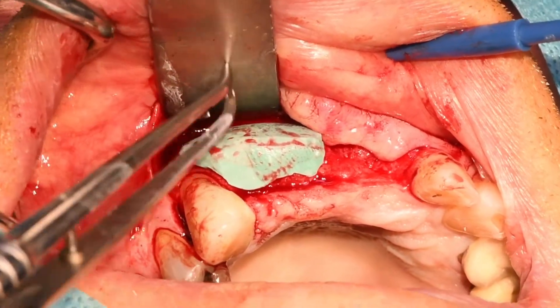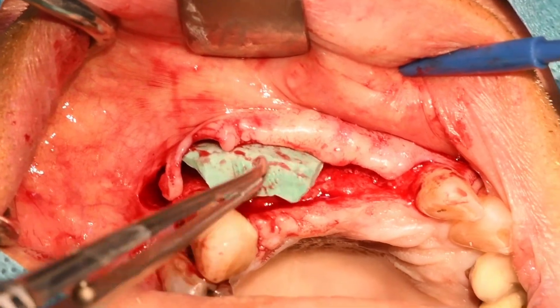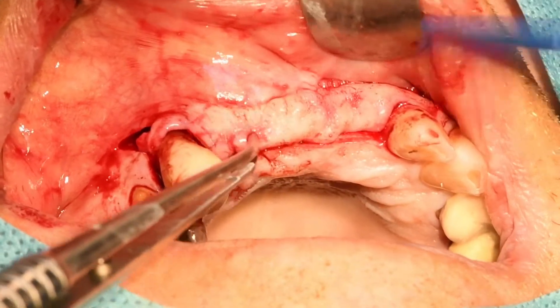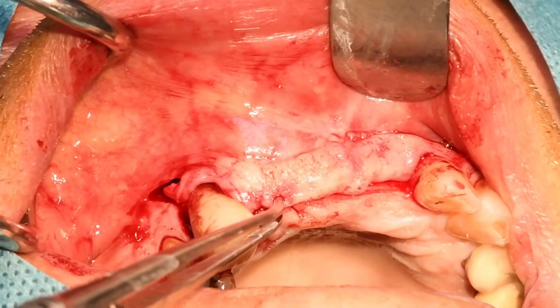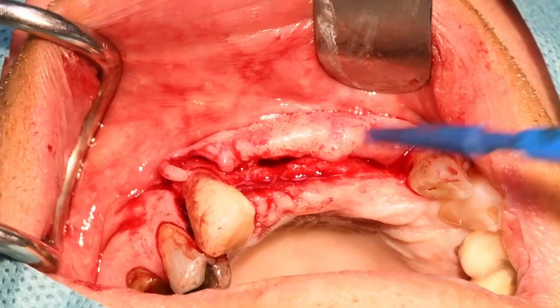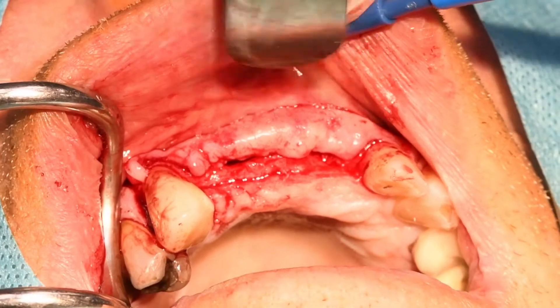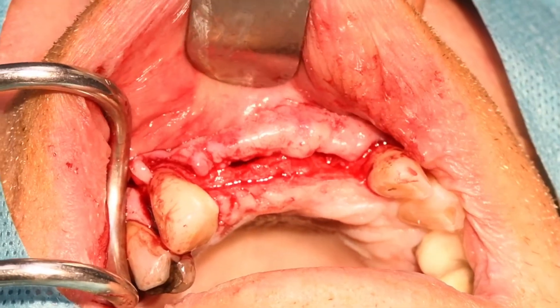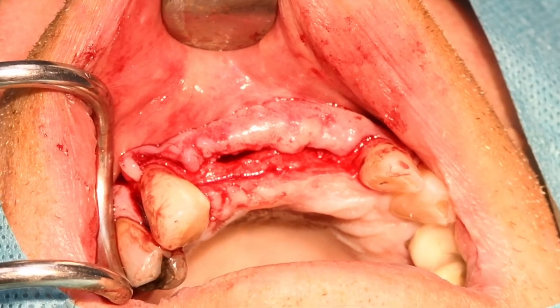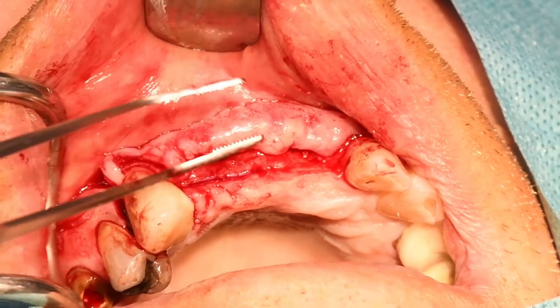C'est juste pour avoir une idée de ce que ça va donner. Il va falloir qu'on tire un peu sur les tissus, ça va pas être simple. On va utiliser le brushing technique de notre ami Joseph Choukrum, et on va venir rompre les fibres périostées.